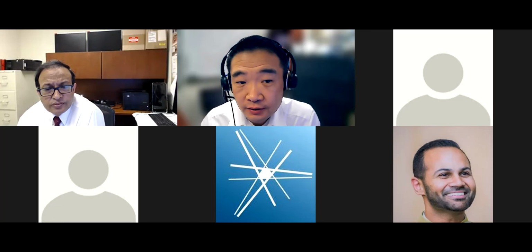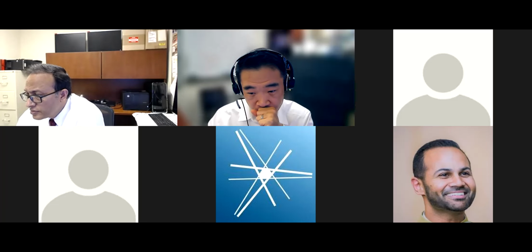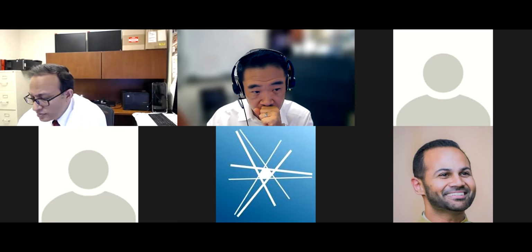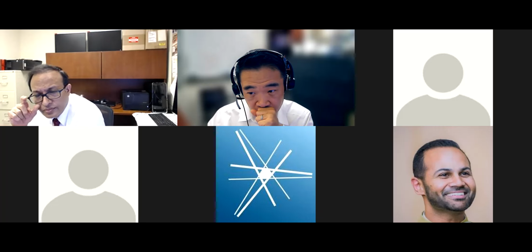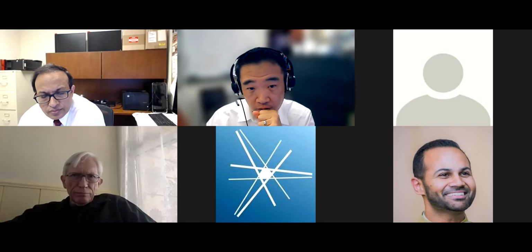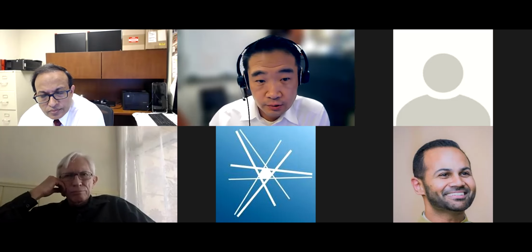You're welcome. I have a couple more questions. You kind of mentioned seeds and LDR. How important are the other modalities of brachytherapy to the entire group? I know that this isn't just the U.S. Am I correct? We have Europe here as well. So I would love to hear how important you think seed implant, pre and post, and LDR is to you guys.